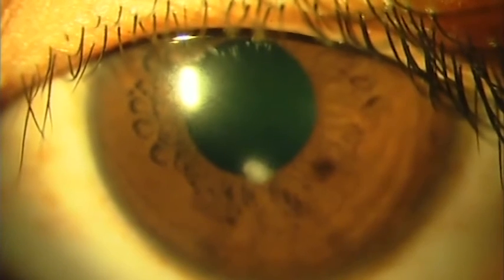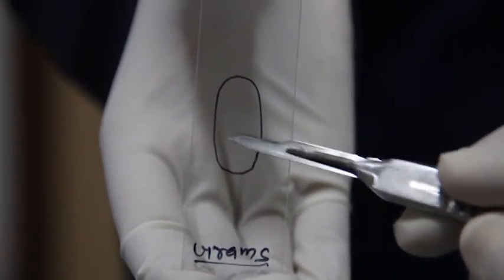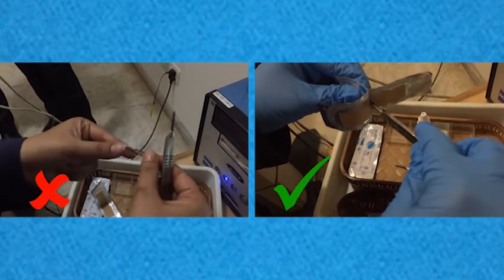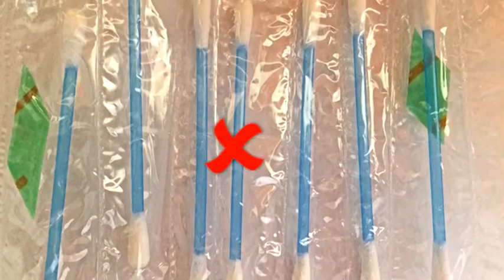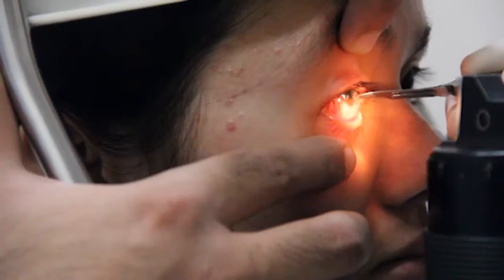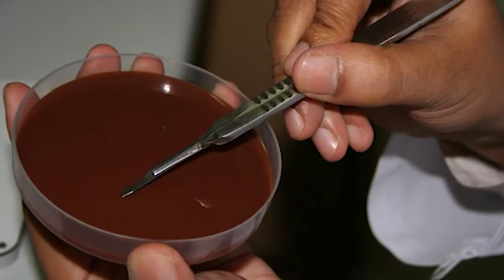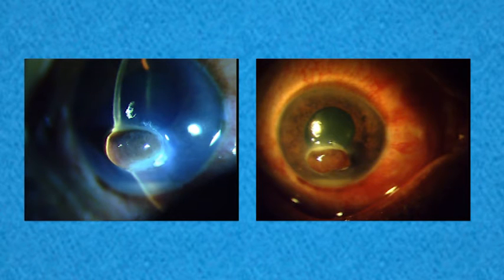There are certain precautions to be taken while collecting samples. The blade should not touch the lid margins or conjunctiva, as they harbor normal resident flora which may give false results. Scraped material should be immediately plated on culture plates to avoid contamination. Slides should be held from the edge, and the 15 number blade should not be touched. Cotton swabs should not be used. The examiner should not talk while plating. No transport media is used — direct patient-site processing is the rule. Gentle scraping should be done in cases of corneal thinning and impending perforations, as vigorous scraping may lead to perforation.